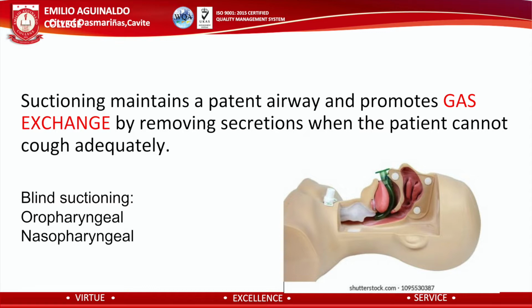The nasopharyngeal suction may be undertaken directly via the nostril without an airway adjunct. If repeated suction is anticipated, a nasopharyngeal airway should be utilized. This is inserted only by those who are trained to do so.